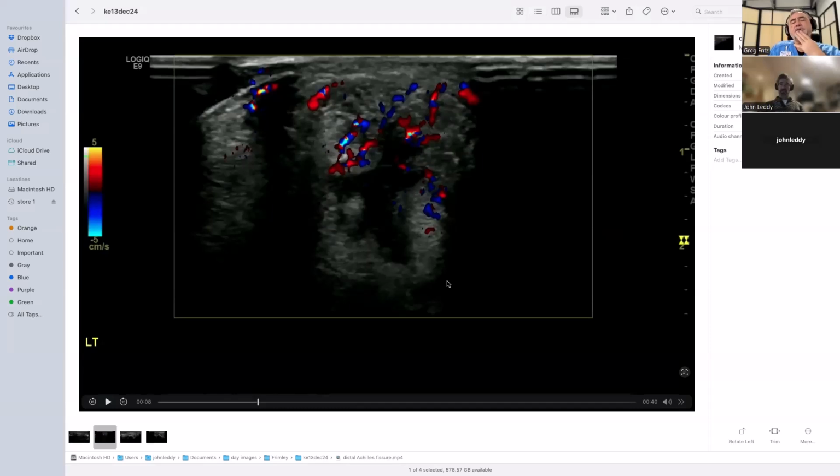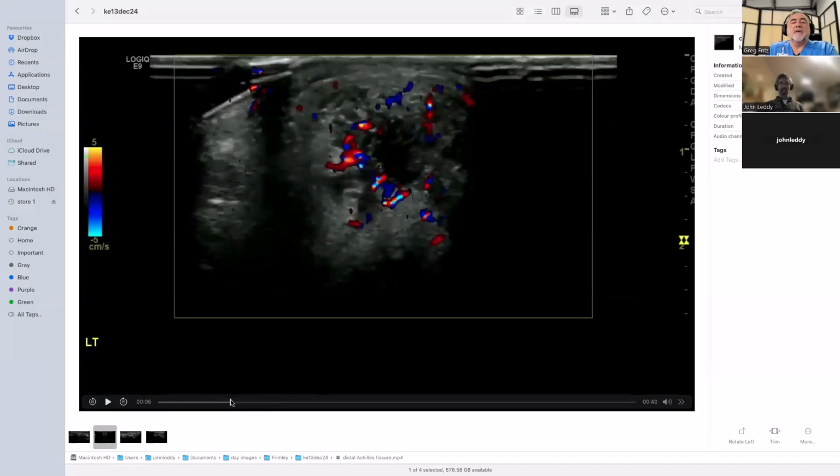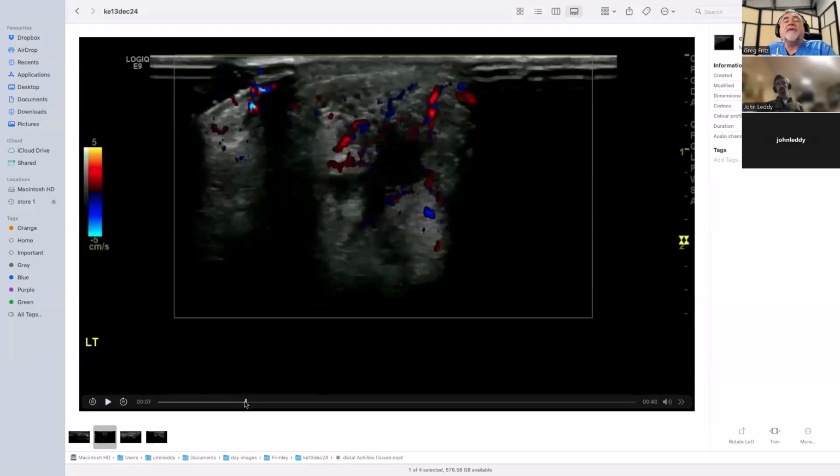I want to understand what you meant by that process. It was not hyperemic at all. When you say that, you're talking about the synovium or the area around the bursa? No, I mean this area here within the tendon, where the low echo region extends into the tendon. It is not hyperemic. We would expect it to be reactive to the flow within the dark area if it were hyperemic. Is that what you're saying?